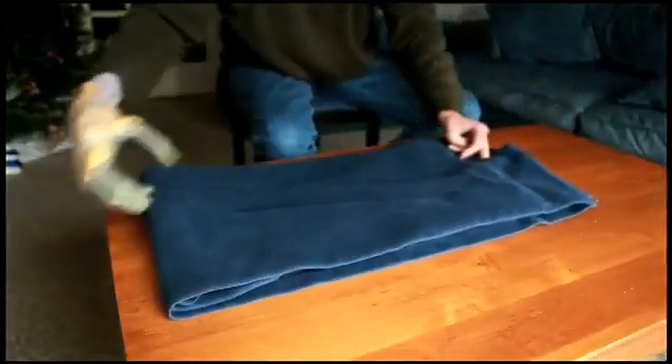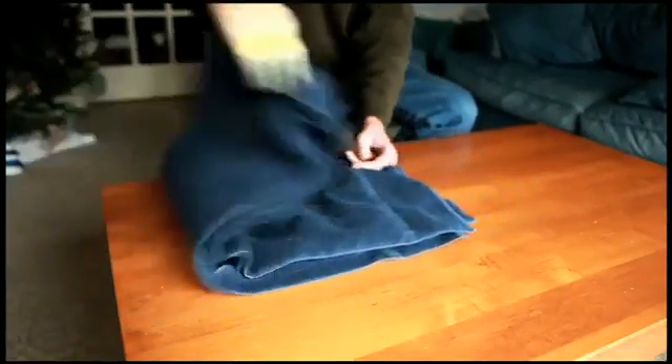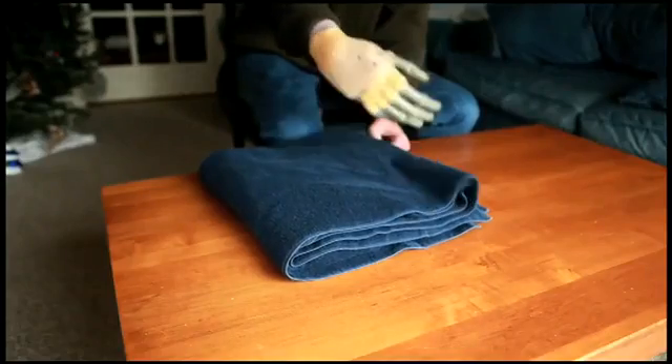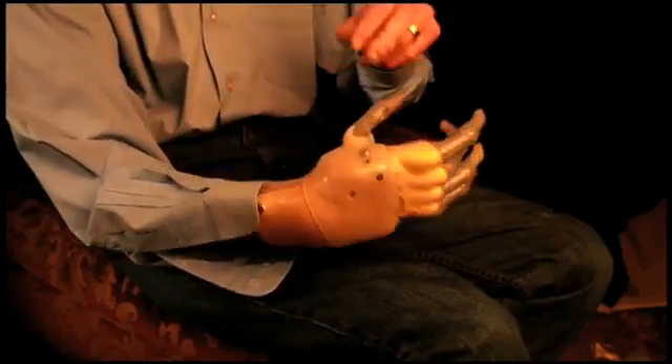Touch Bionics hand gives me one thing that no other prosthetic can give me, which is the ability to grip. With the Touch Bionics hand on the right side, I can do things a lot faster. So I can fold laundry faster. I can pick things up and walk around. I can pick up my kid's Lego.